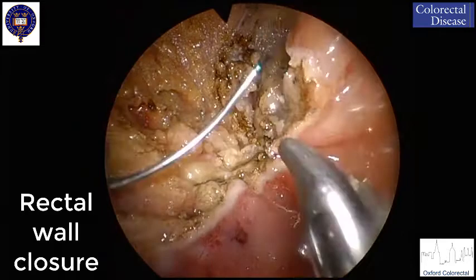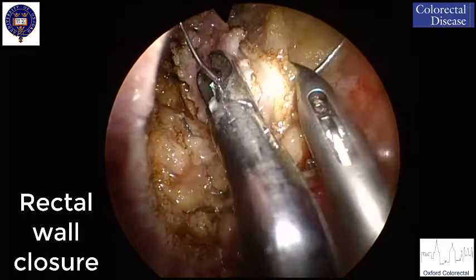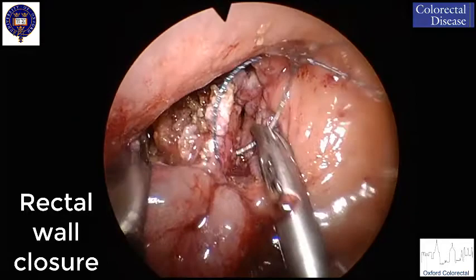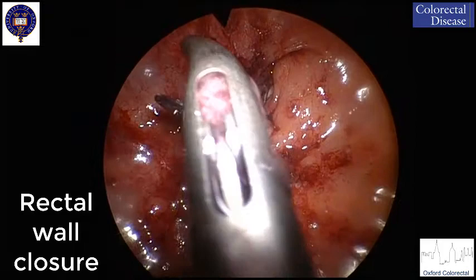A second layer of multiple V-lock 3-0 sutures were used to perform mucosal approximation to obtain defect closure and hemostatic control. A lot of attention was paid on the suturing of the 360-degree defect to minimize the risk of twisting and stenosis, as correction later on is virtually impossible while using a barbed suture. Although the lumen appeared to be narrowed, it could easily be passed by the scope.